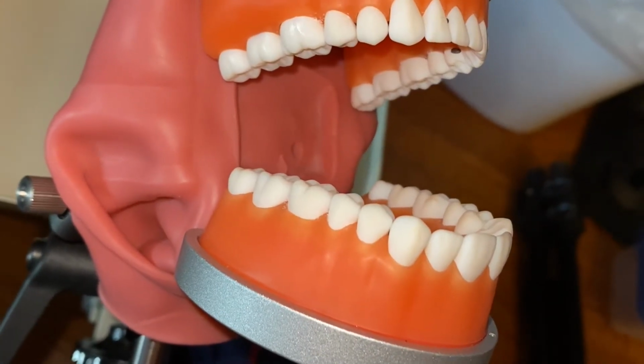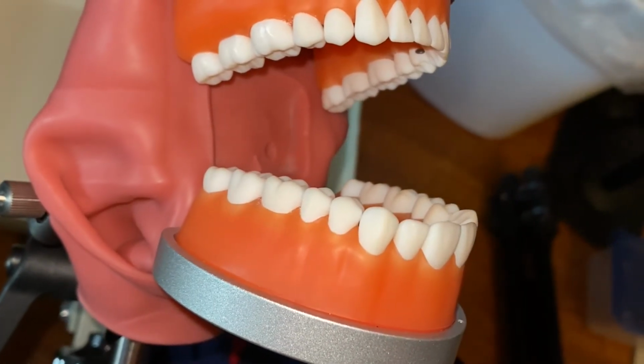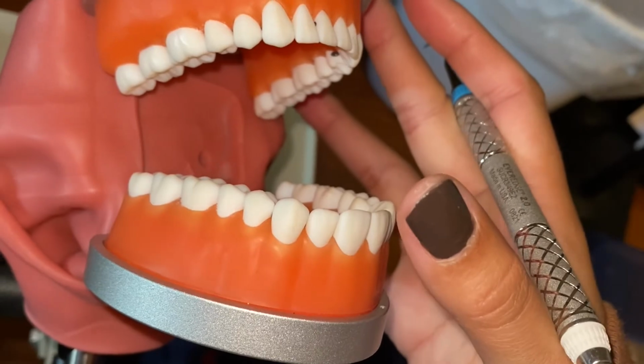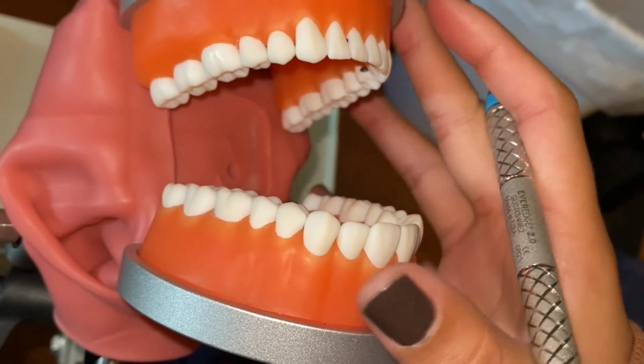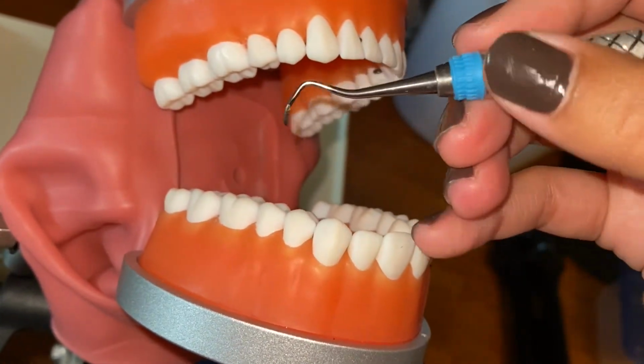And working on the buccal surfaces of 13 and 14, I am now sitting at 11 o'clock of my patient, and I did adjust the typodont to move towards me. So I would ask my patient, still with their chin up, to just turn their head towards me.